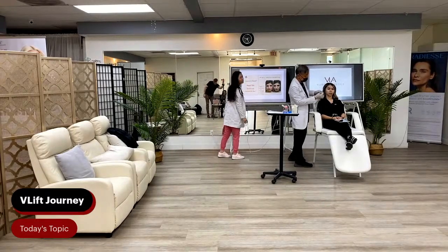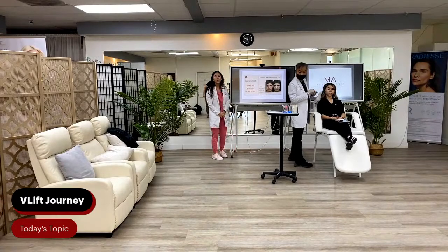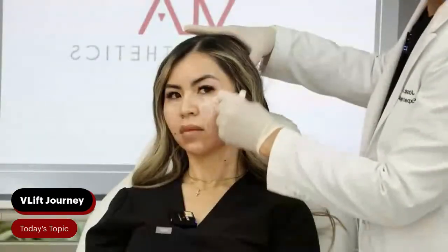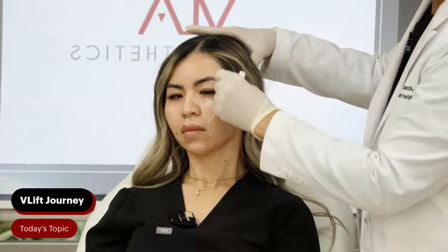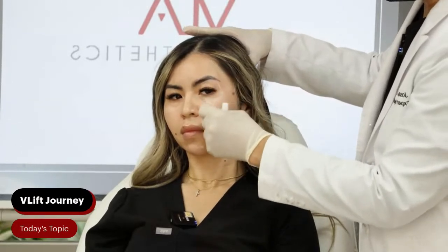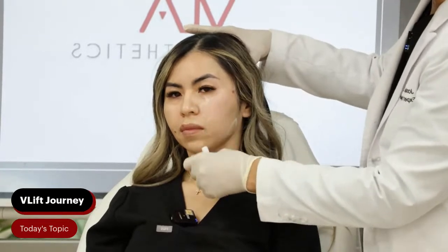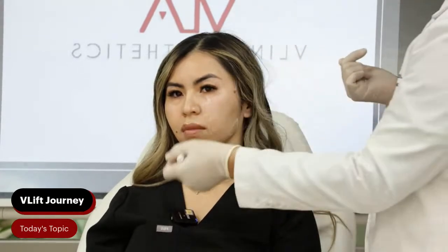Here's the masseter right here. We also melt some of the jowl fat and the submental fat using either Kybella, CoolSculpting, or energy devices like Ultherapy or Potenza. And then we do a little bit of chin extension using fillers to give a very nice oval and narrow lower face.